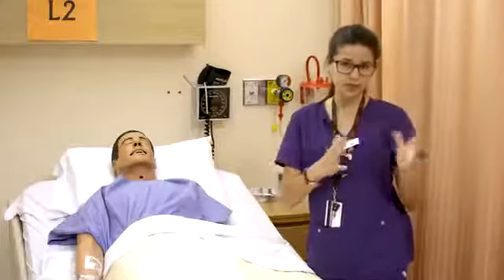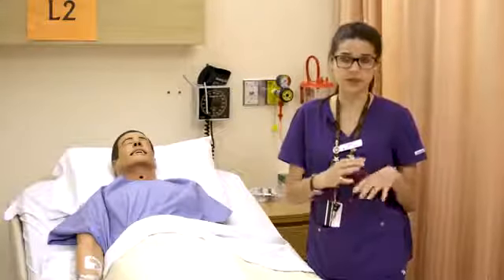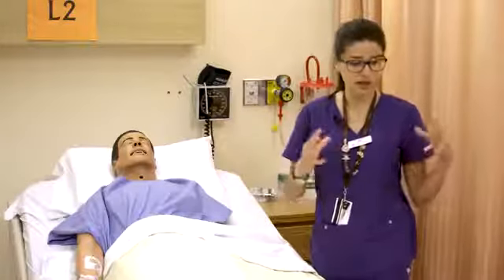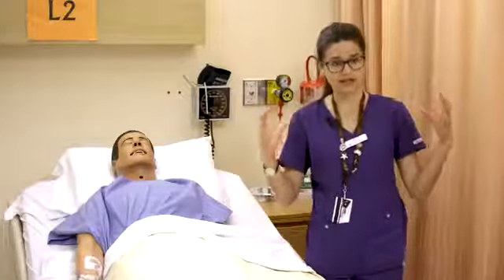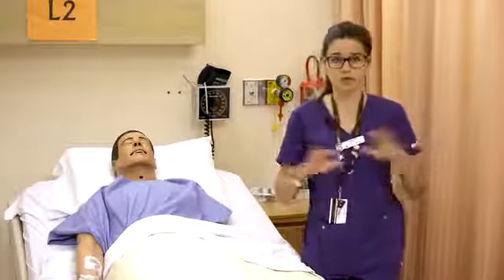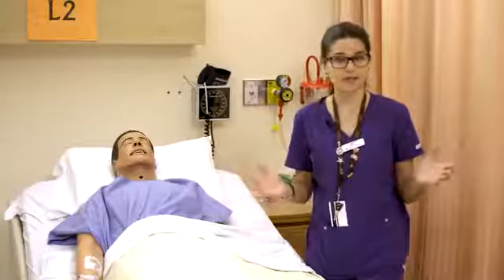When we talk about the FiO2 levels of each different delivery system, we're talking about the fraction of inspired oxygen. Think of it as a percentage. Room air, or just regular atmosphere, has about 21% oxygen.